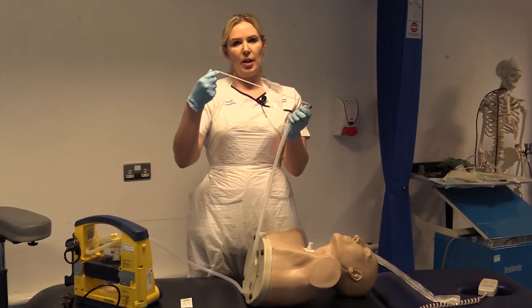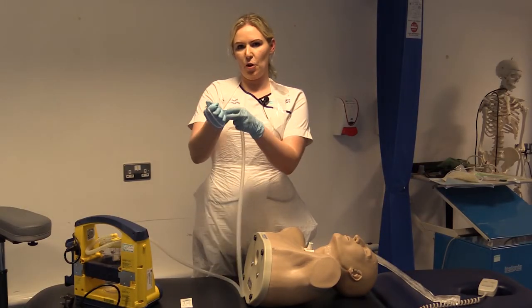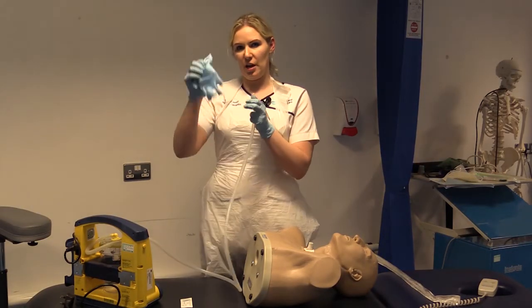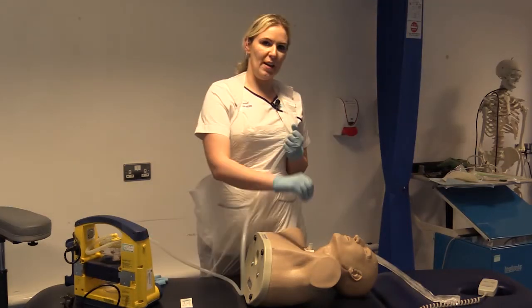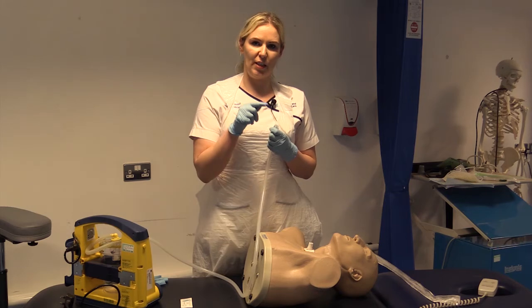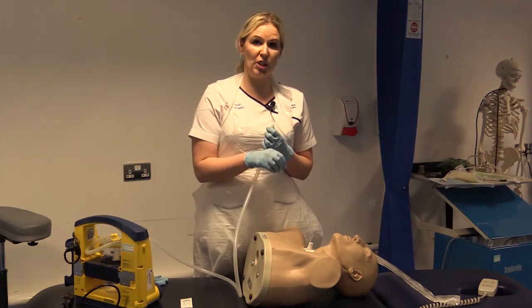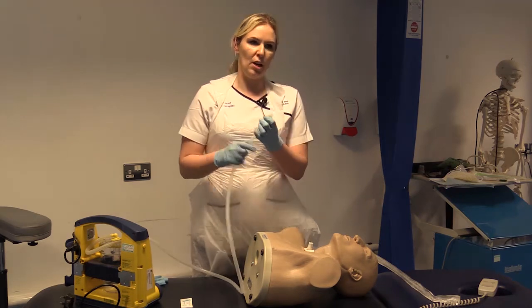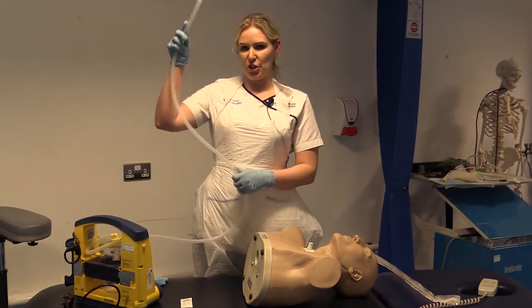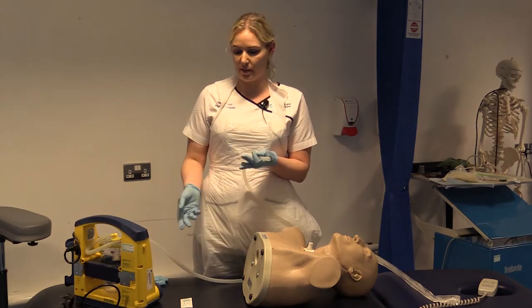Okay, you're going to wrap your catheter around your dominant hand. You're going to pull your glove over the end of your catheter, and you're going to discard of that. You're going to reapply your oxygen. You're going to reassess your patient again and decide whether you need to repeat your suction or not. If not, you're going to check your patient's clinical obs and make sure they're returning to normal. You're going to flush out your suction tubing, and you're going to remove your PPE and wash your hands.